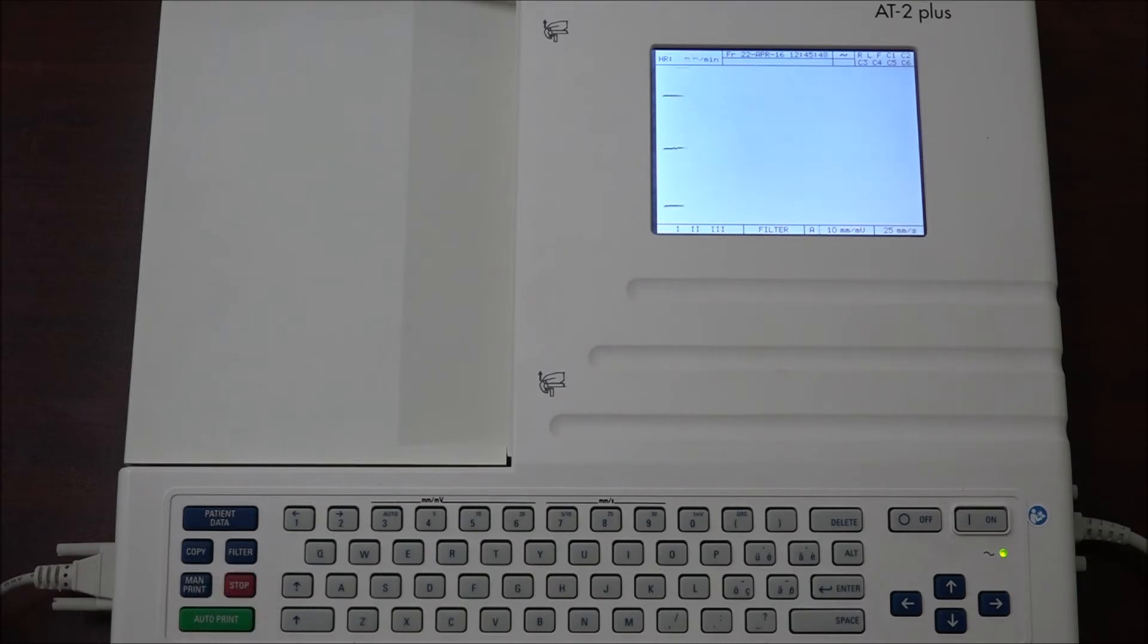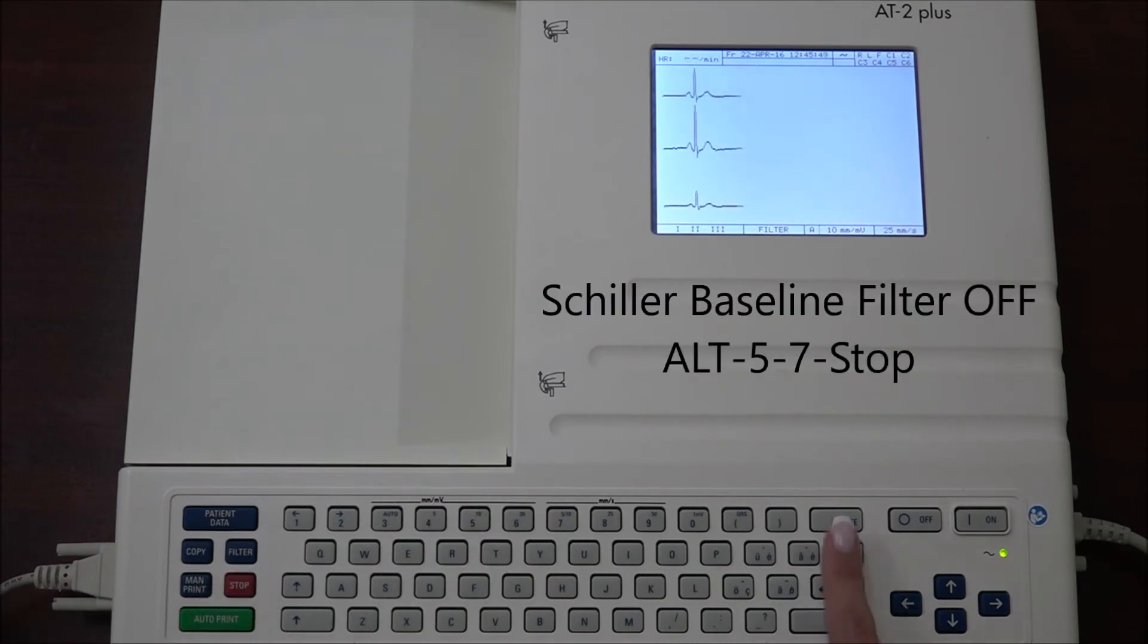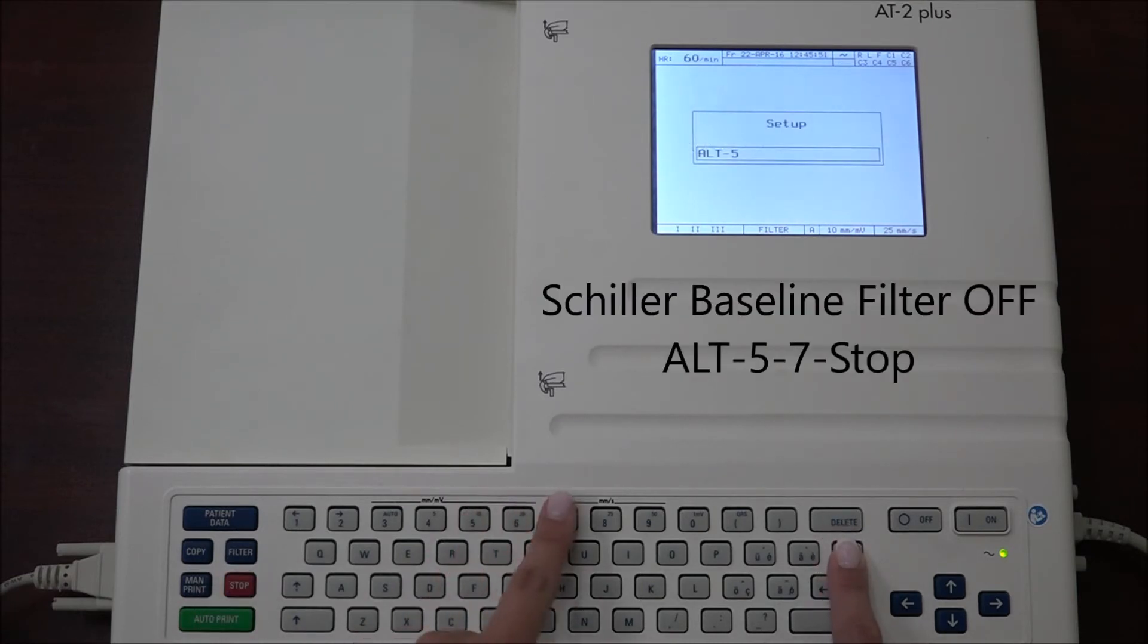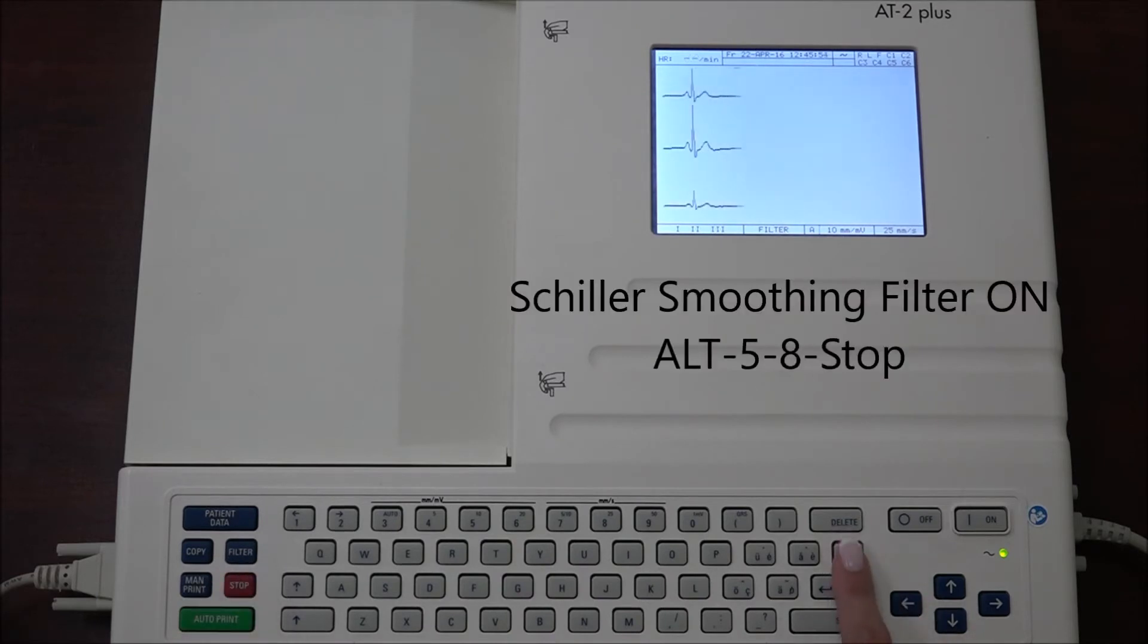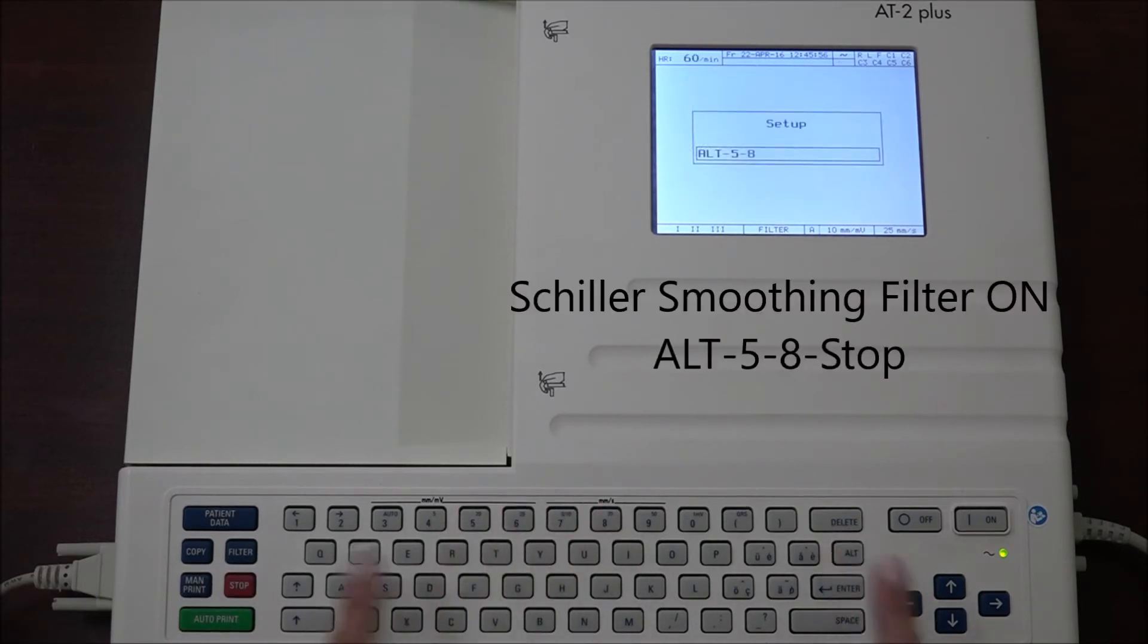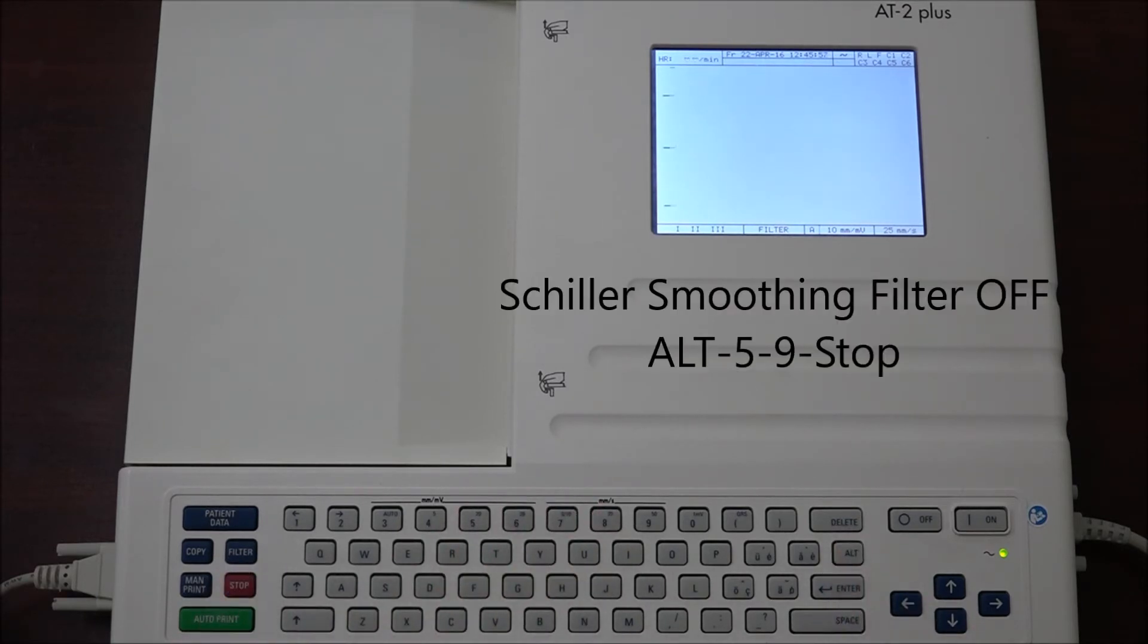To turn the baseline filter off, press ALT 5 7 stop. To turn on the smoothing filter, press ALT 5 8 stop. And to turn off the smoothing filter, press ALT 5 9 stop.